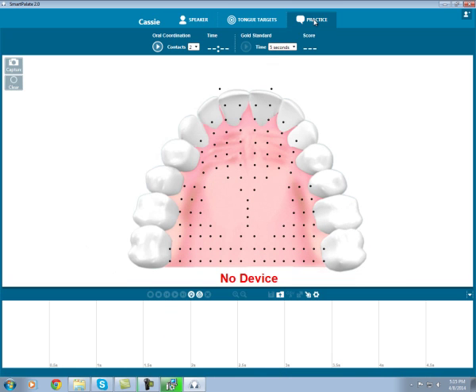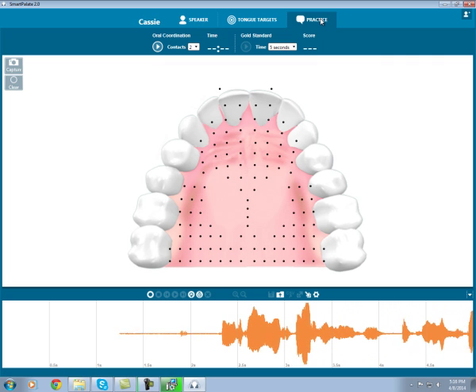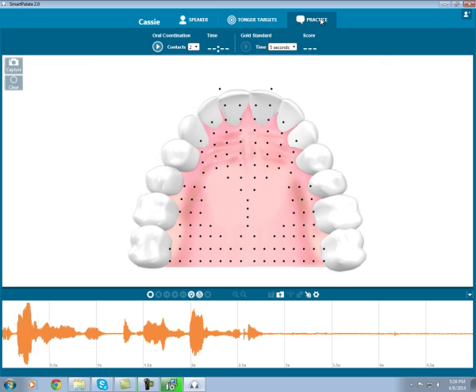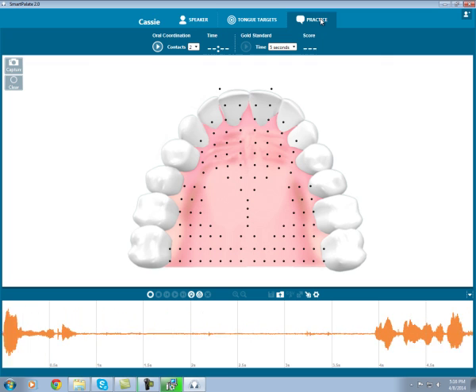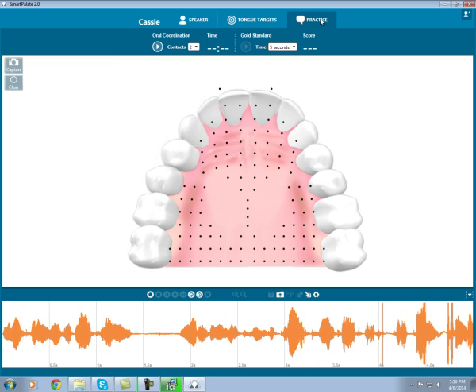This is the view that allows you to actually see your tongue to palette contact and is where you will spend the majority of your time in the software. Right now, I do not have my data link or smart palette connected. But when I plug in the data link, you will see the red no device disappear and orange audio waves appear along the bottom of the screen. When I put in my smart palette, you will see my tongue to palette contact display as I talk.